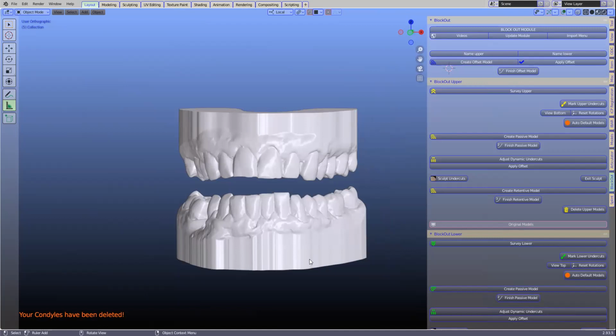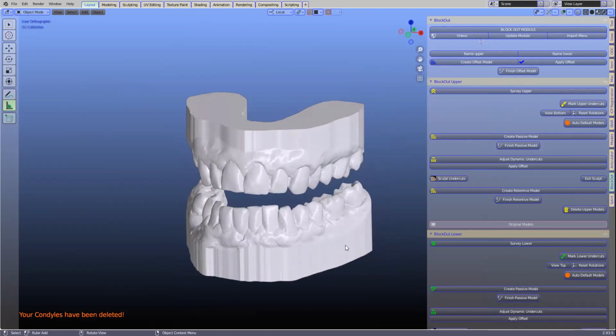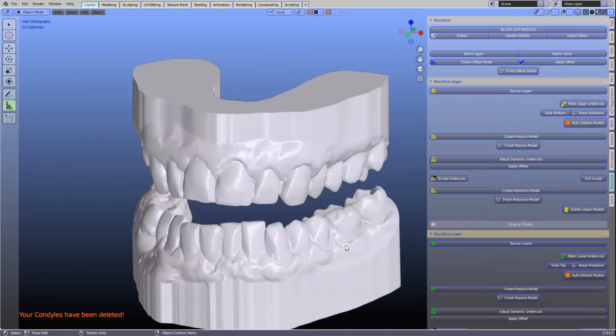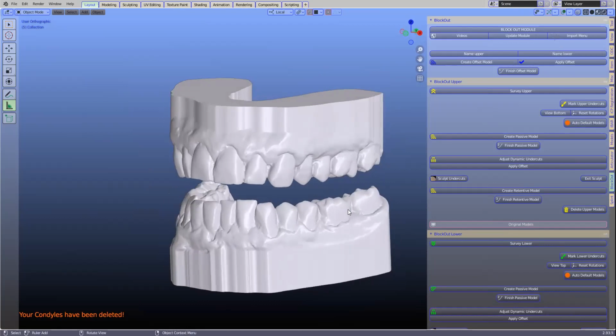Okay. A quick question about the clinician giving us, or whoever's doing the CAD work, the protrusive physiological bite. Yes, but you're saving this entire step of the articulation. If you get it in this open bite scenario already, it's a big time saver. Well, how long did it take me, minus all of the chit chat? All right. Okay. Granted. But there's nothing better than the jaw. Even a digital articulator, I don't care what program you use, it's not going to be exactly the same in every person. Do you know what I mean?